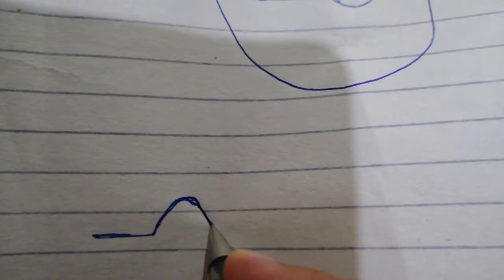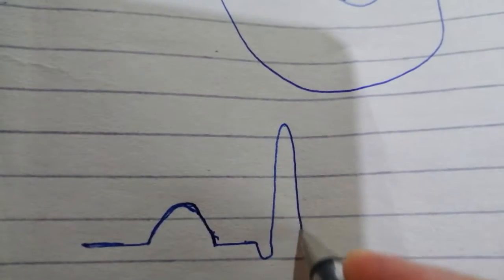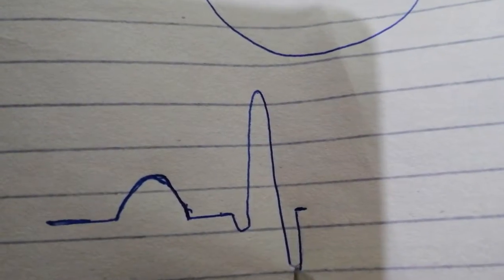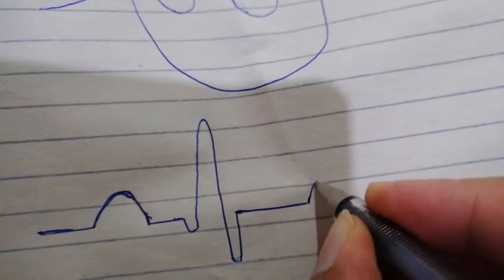showing when the atria are in the process of depolarizing but have not depolarized completely. Then we have the QRS complex showing when the ventricles are depolarizing but not completely depolarized. Then we have this part over here, which is fine, when all of it is depolarized. Then we have the T wave, in which repolarization happens.